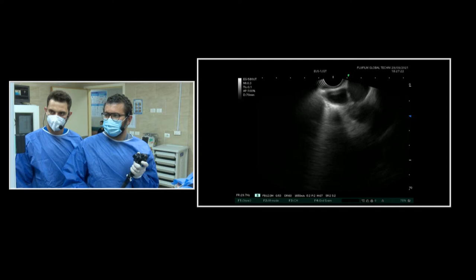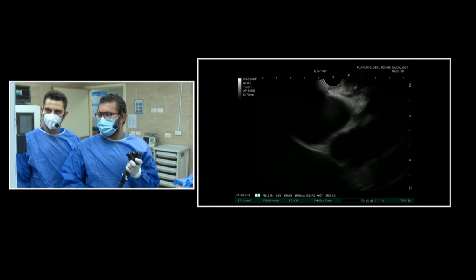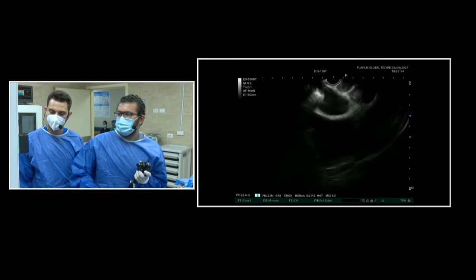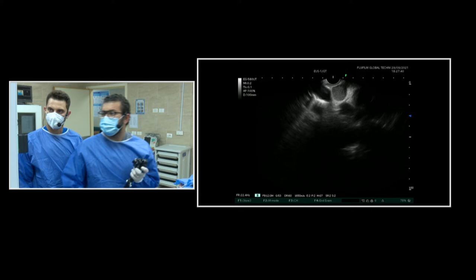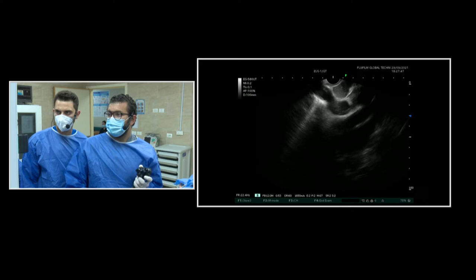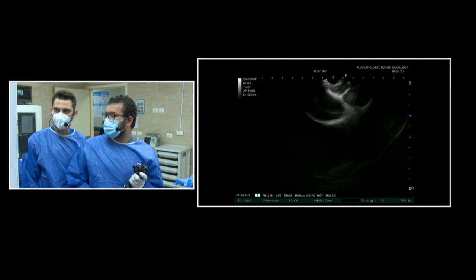Here we'll find the aorta and aortic valve. Left atrium and left ventricle, aortic valve, aorta. And the very interesting finding here — the mediastinal lymph nodes, and subcarinal lymph nodes here. Can we point at it? Yes. This is the one that we can see, a little bit hyperechoic at the top of our screen. Some of them, very interesting, have calcifications inside.